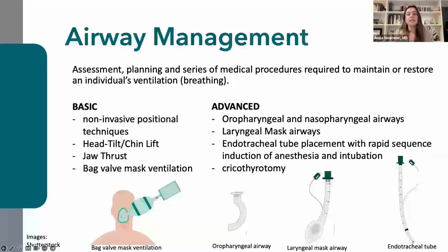Let's begin by reviewing the definition of airway management, which is the assessment, planning, and a series of medical procedures required to maintain or restore an individual's ventilation, also known as their breathing. This encompasses both basic and advanced management. Basic airway management may be used alone for mild airway obstructions or in combination with advanced airway techniques. This includes non-invasive positional techniques such as a head tilt or chin lift maneuver or a jaw thrust maneuver, both of which can alleviate the mild airway obstruction by moving the tongue.